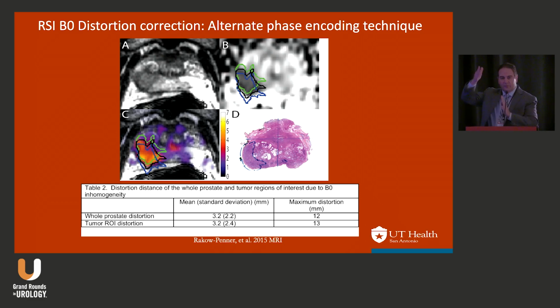What happens is they take these pictures over time, and it's like taking a paintbrush on a glob of paint and spreading it one way. So everything will be a little bit shifted one way. What you can simply do is click the left to right and go the opposite direction, and you can correct it.